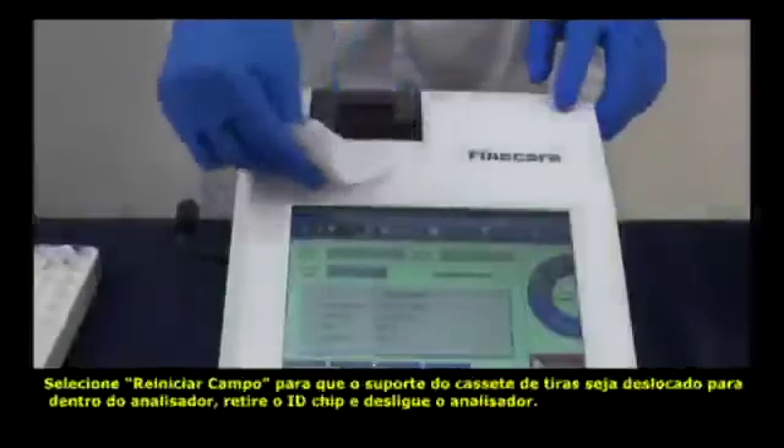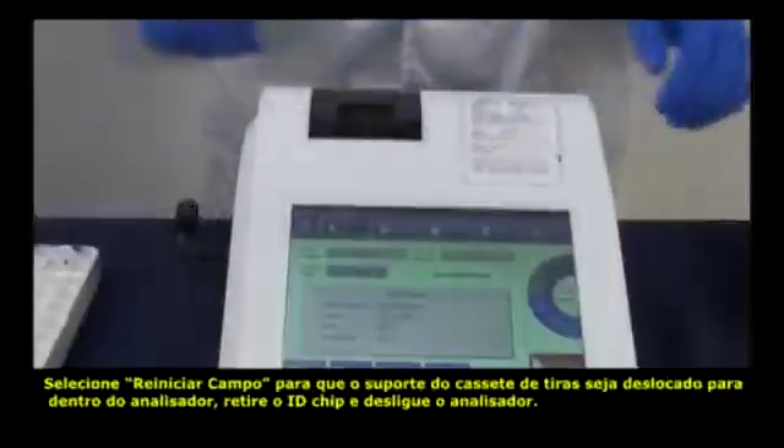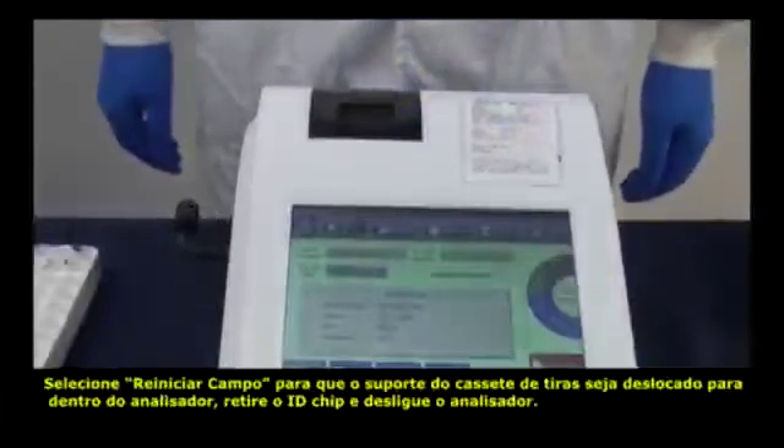At last, press Reset on the slot, take out the ID chip, and turn off the analyzer.